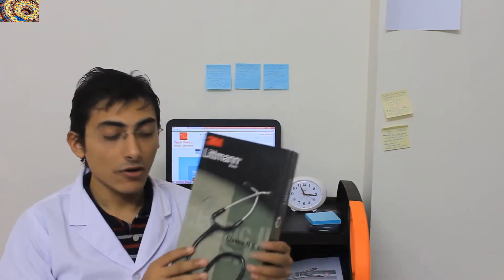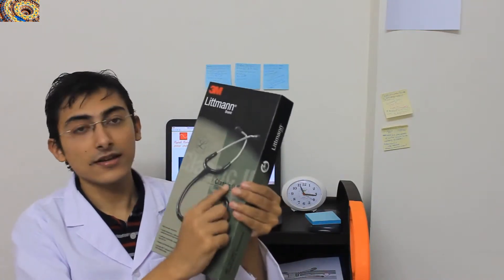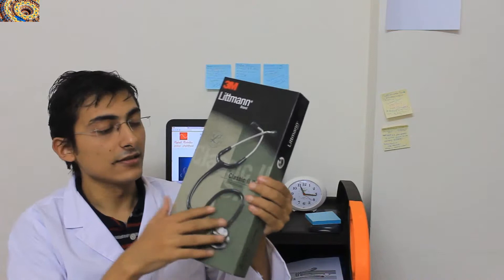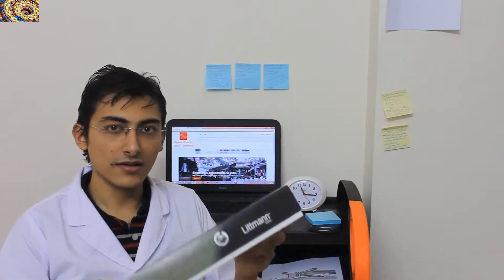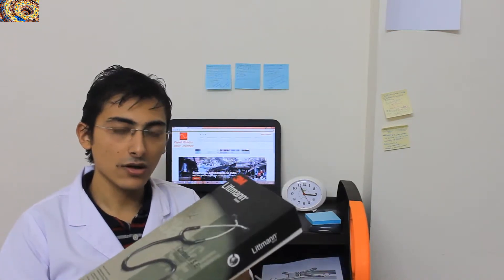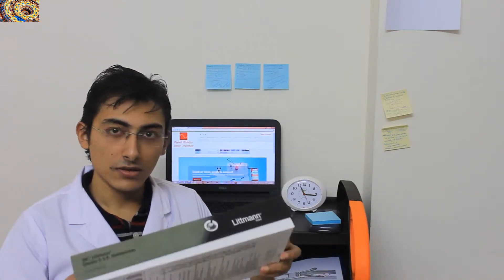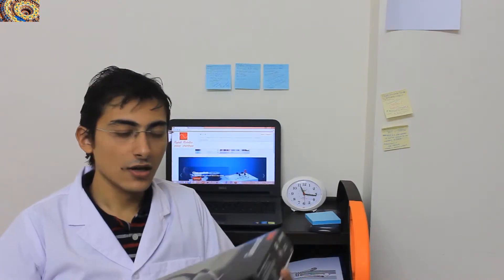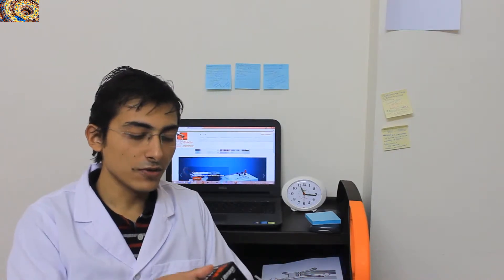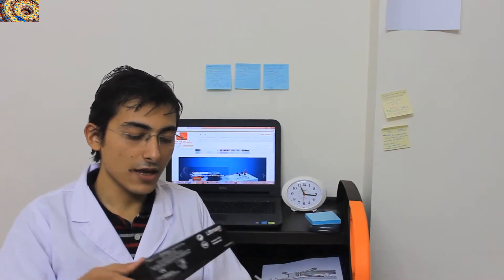This particular model is Classic II SE, so you can say it is a good model and an average model. But the stethoscope is really nice. So let's open the box and see what you will find.